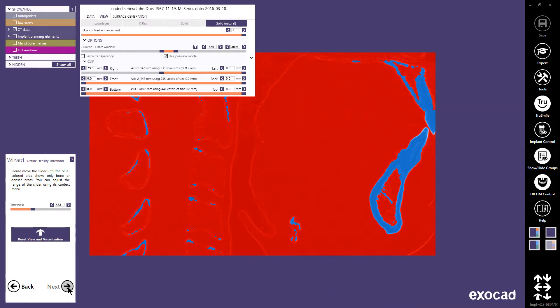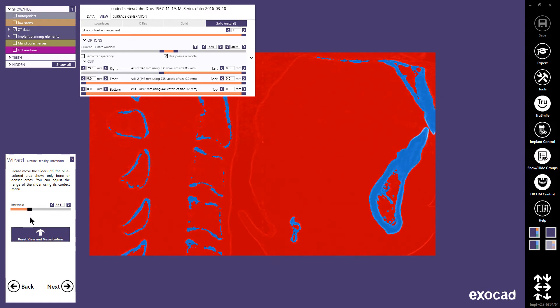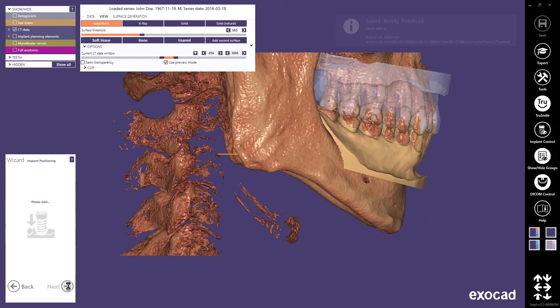In this next step, you can define a density threshold by moving the slider to show the denser parts in blue and the less dense parts in red. Continue with Next.